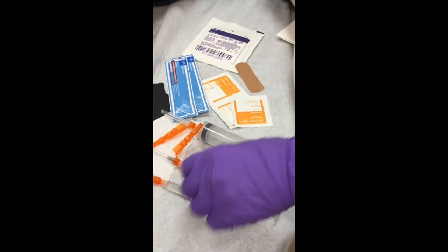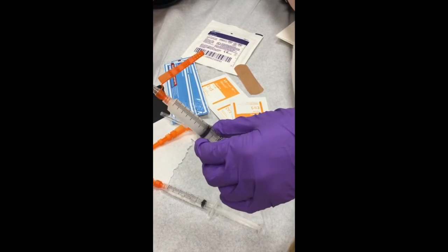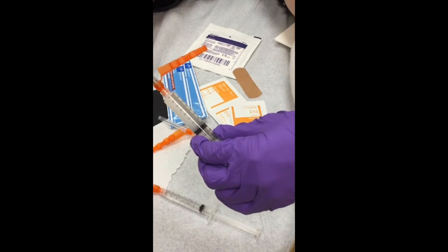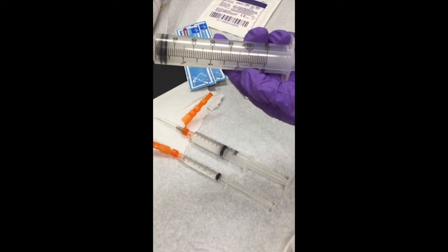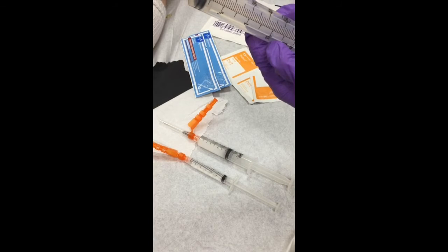We have our standard cortisone injection — we use 6 cc's of quarter percent Marcaine mixed with 40 milligrams of Kenalog. We also have a standard 60 cc syringe loaded up with an 18 gauge needle for the aspiration.